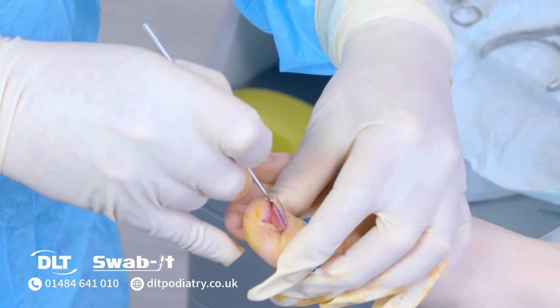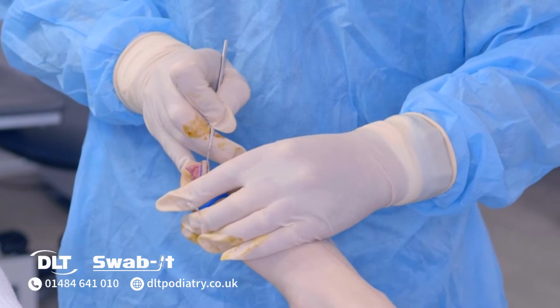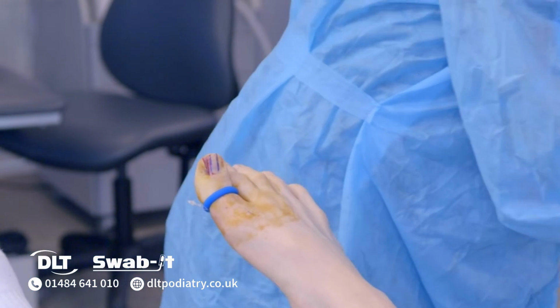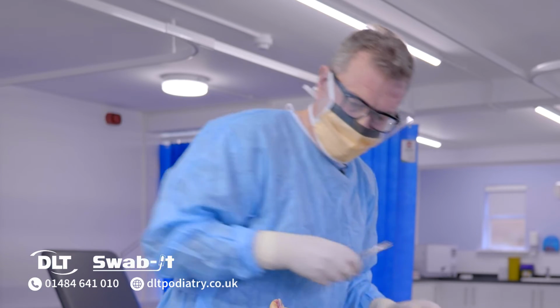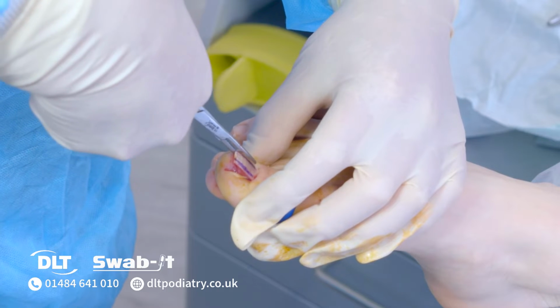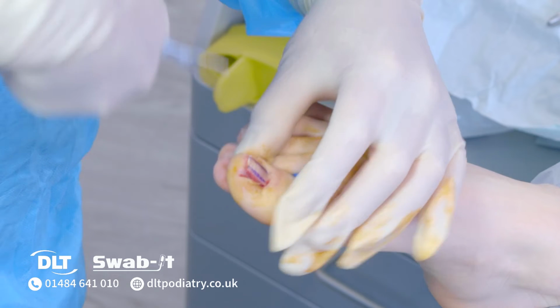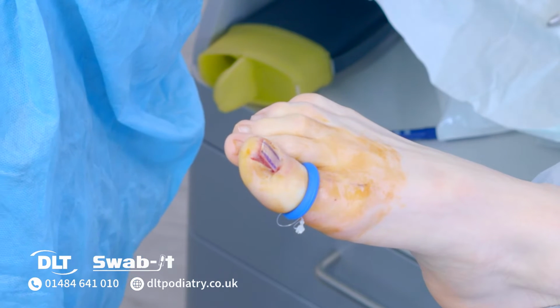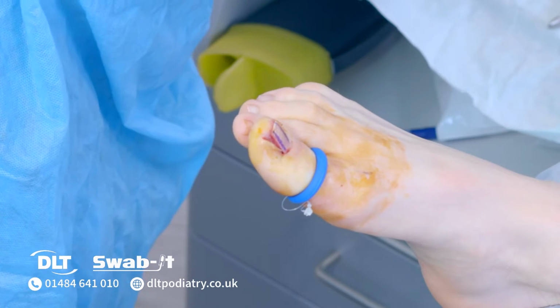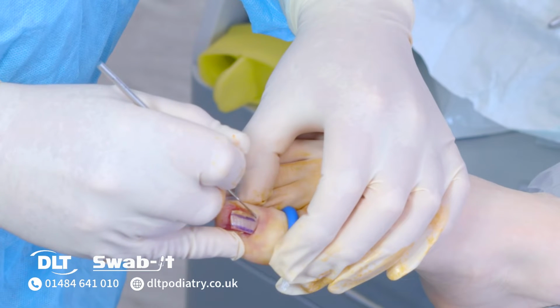And when you're completely separated, you can see there's no damage to the nail bed with the elevator. You take, again, your Spencer Wells. I go from corner to corner. I'll just make sure that's separated. Makes it easier.